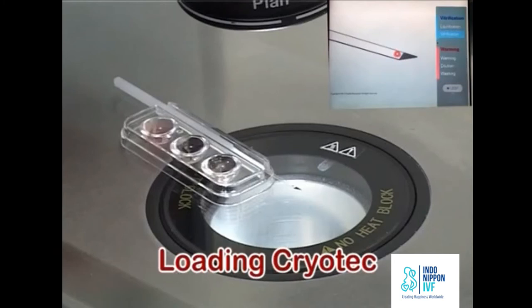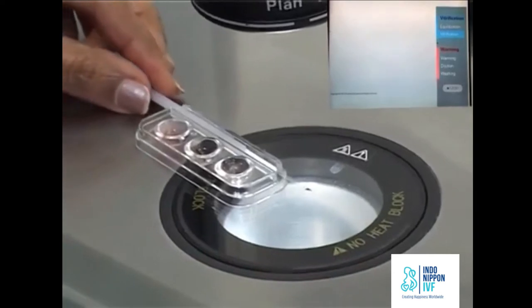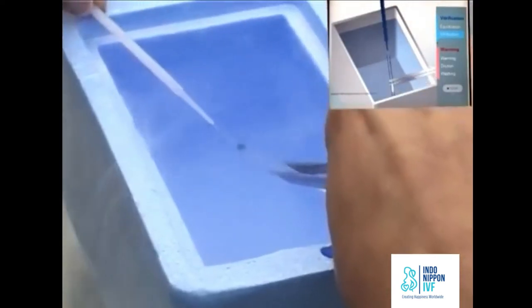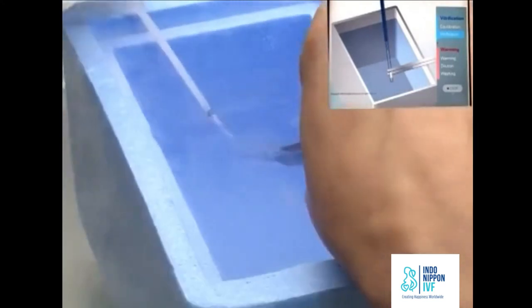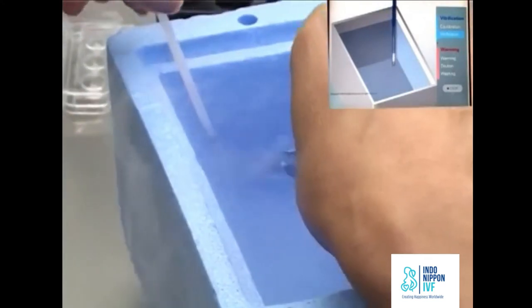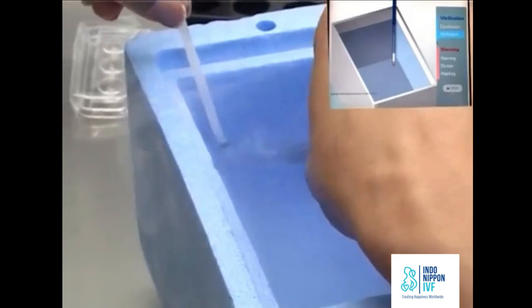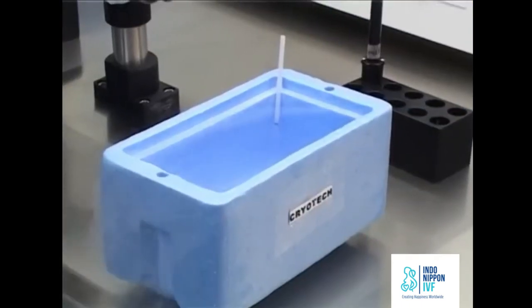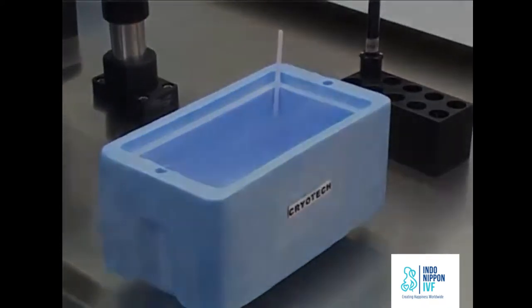One cryotech stores up to four oocytes so you can make four droplets. Immediately submerge the cryotech into fresh liquid nitrogen. Put the straw cap on cryotech in the liquid nitrogen. Ensure that the cap is fitted tightly onto the cryotech. Put the cryotech in a cane and store it in a liquid nitrogen tank. Do not expose the cryotech to air until warming.